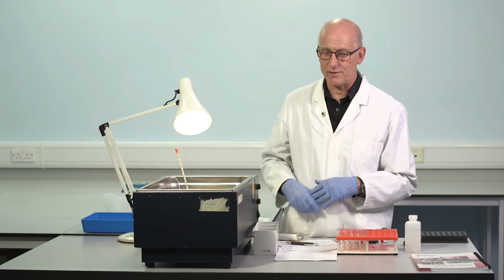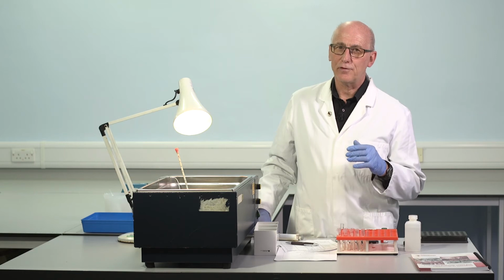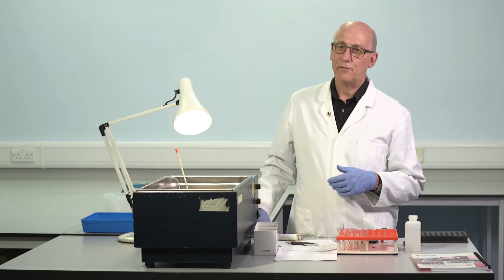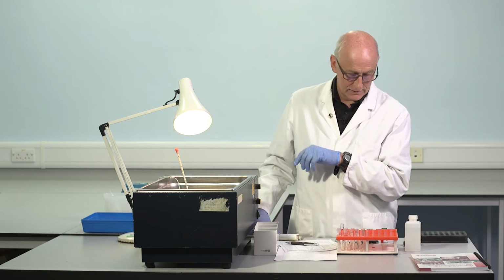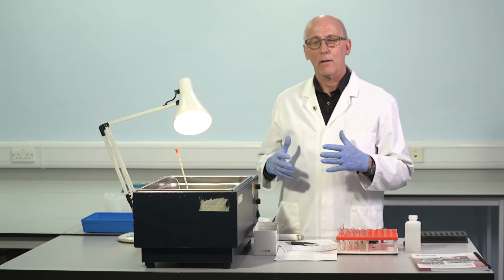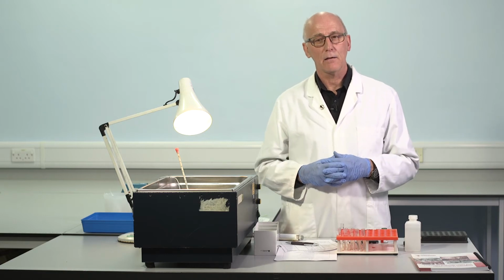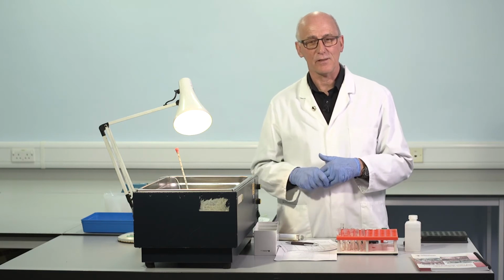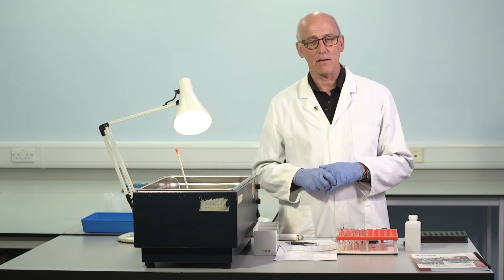There's an even more important reason for doing 3 dilutions. It absolutely improves the accuracy in the presence of interfering substances. The most common interfering substance, lupus anticoagulant. The majority of APTT reagents, which are used in factor VIII assays, are affected by the presence of lupus anticoagulant. And if you do the first test dilution, in this case 1 in 10, this is a higher concentration of antibody present compared to the 1 in 20, where there's obviously a lower concentration of antibody, even to the 1 in 40, a lower concentration still.